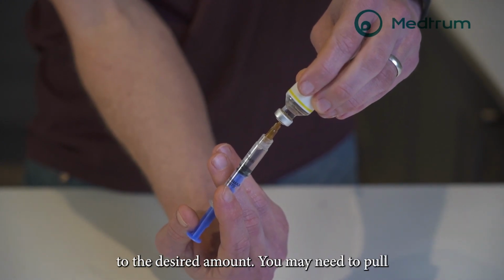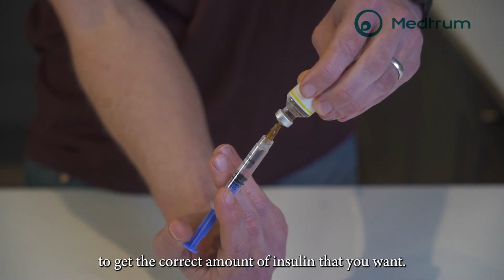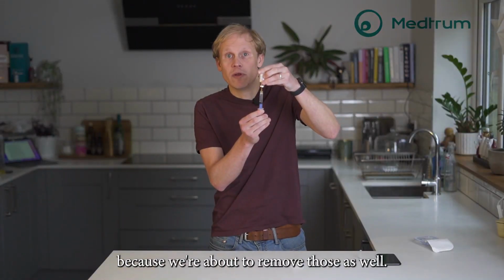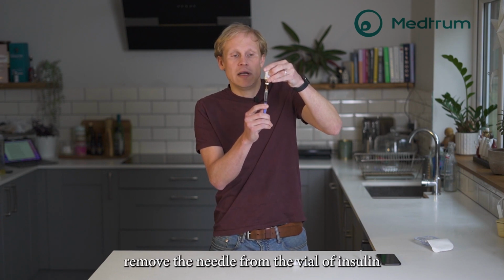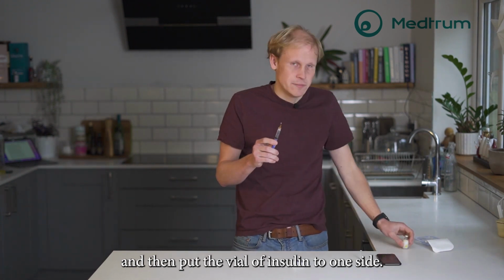You may need to pull a little bit on the plunger to get the correct amount of insulin that you want. Don't worry if you introduce any air bubbles here, because we're about to remove those as well. Once you've filled the syringe to the amount of insulin that you want, remove the needle from the vial of insulin and then put the vial of insulin to one side.